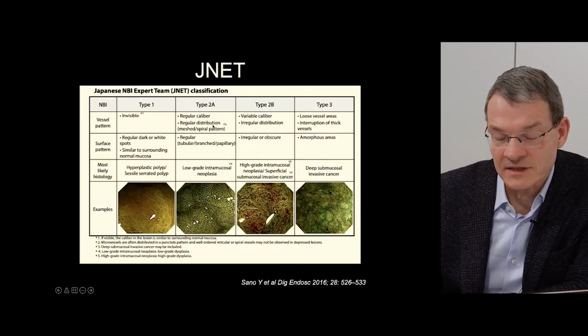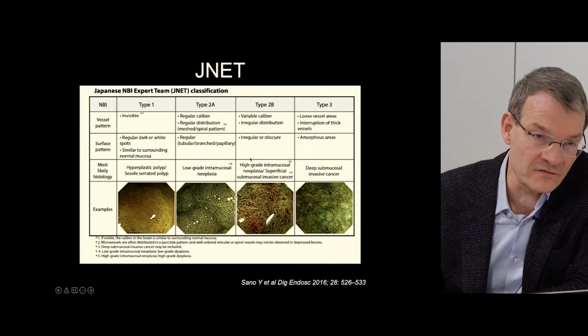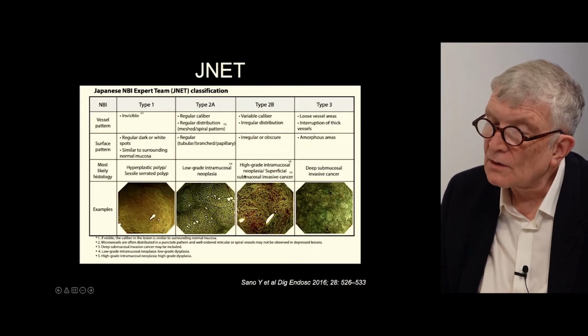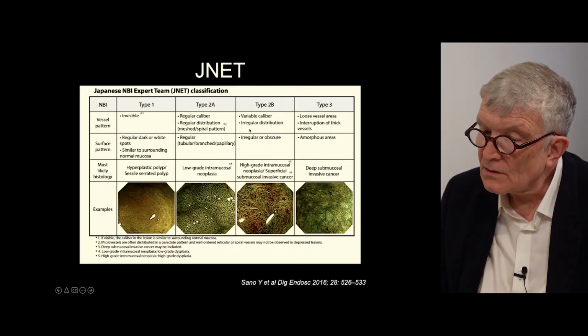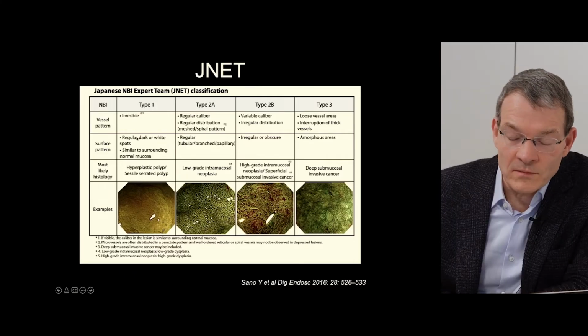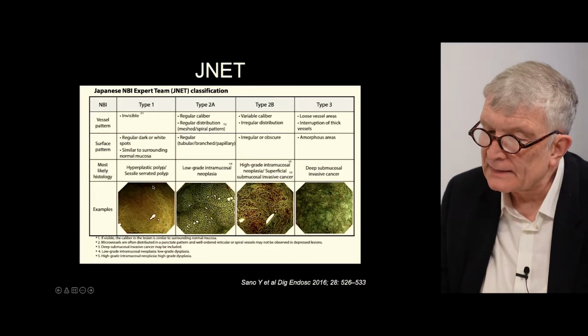And the most important question nowadays for the practical approach is, can we still go for EMR, or do we have to do an ESD? Can you please correlate it to pathology? So type 1 is normal. Type 1 is normal. No, it's type 1. The serrated polyps are also under this.